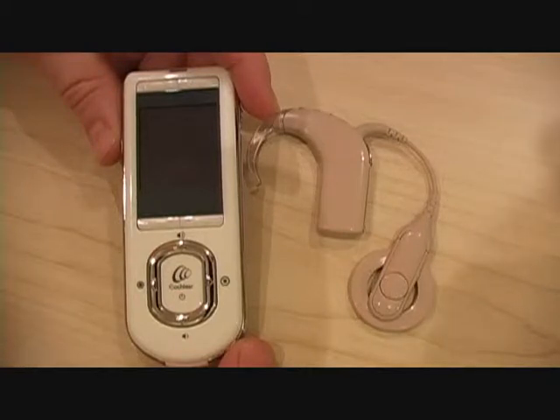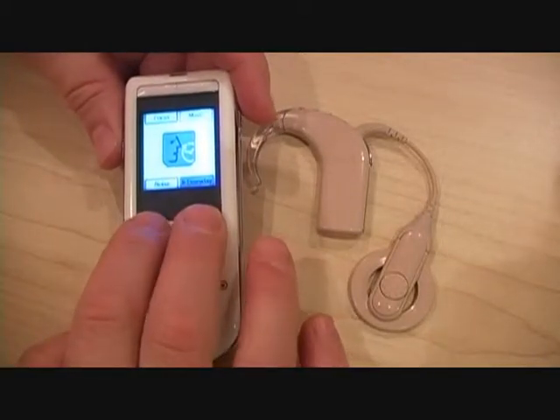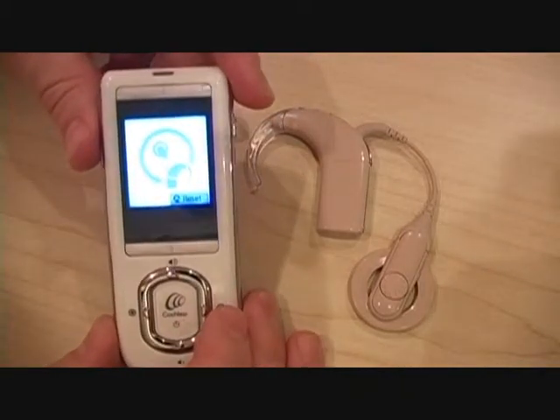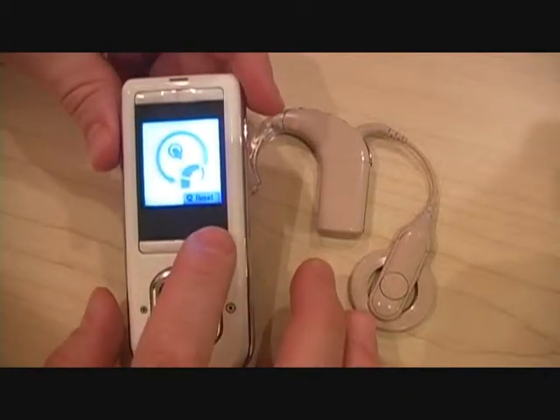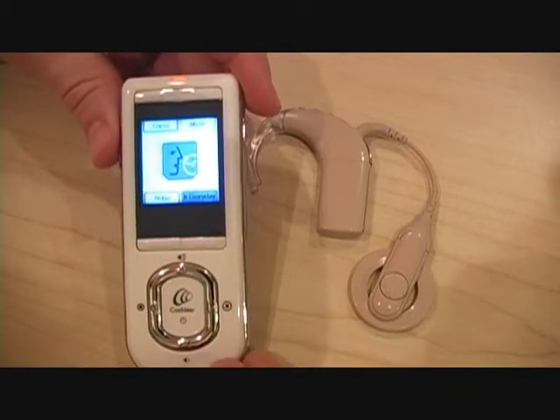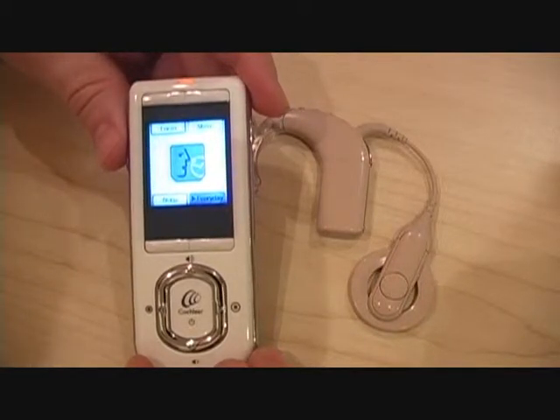Let's start by checking the settings on your processor. Your audiologist will have set default volume and sensitivity settings on the processor. Using your remote assistant, press both of the lower buttons at the same time. You'll see an option to reset your processor. Choosing Reset will reset the volume and sensitivity and other settings to the settings your audiologist gave you.